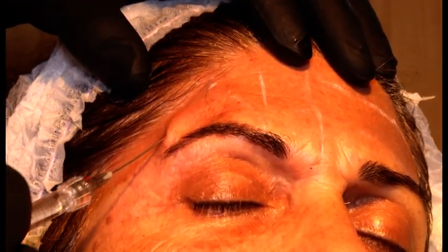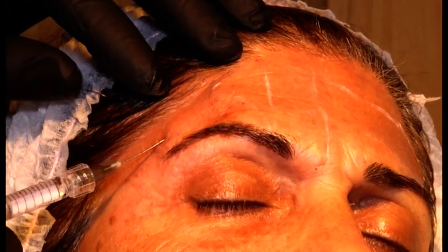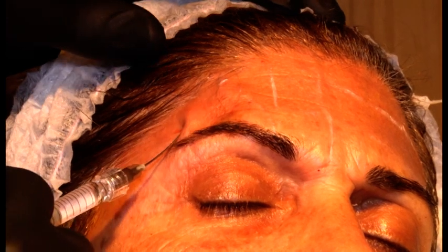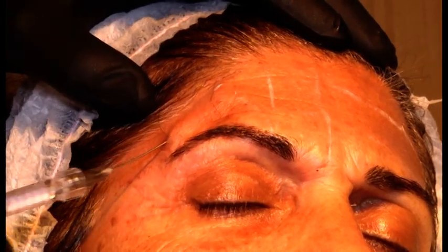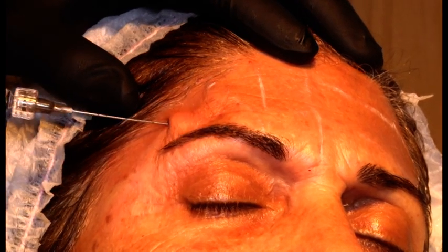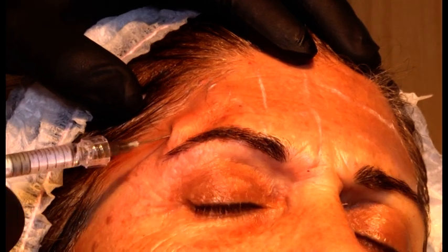So I feel the cannula scraping over periosteum. And the beat in the background is getting louder. So I feel very close to you guys now.